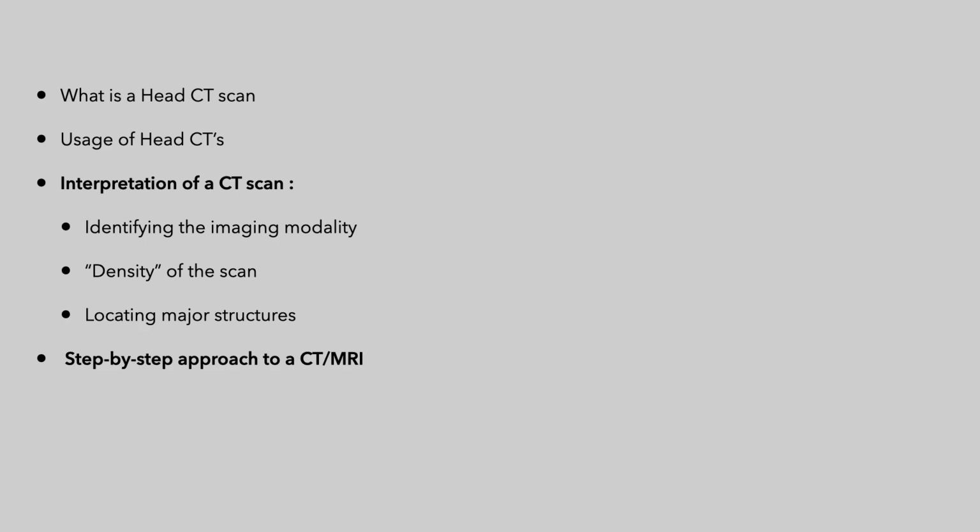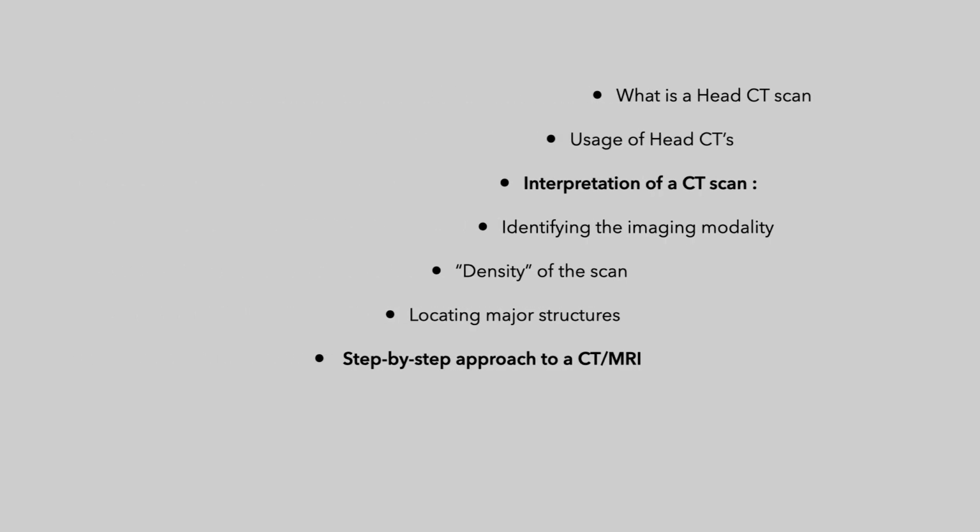So we're going to start off by talking about what is the head CT scan, usages of a CT, how to interpret a CT, and finally, if we have time, a step-by-step approach.